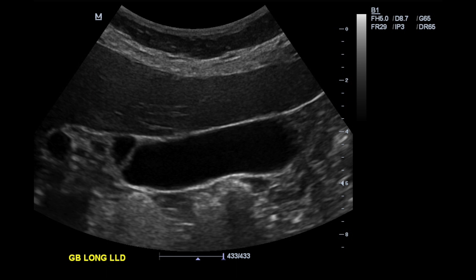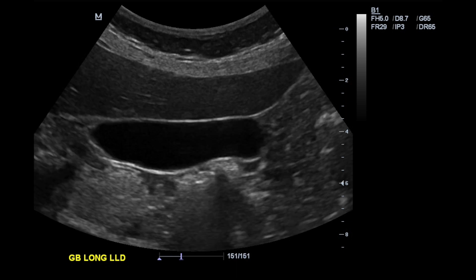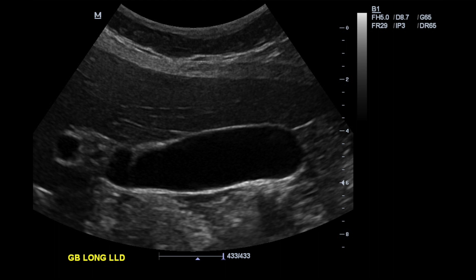Those are all our pictures with the patient supine. Next, we have the patient roll into LLD — left lateral decubitus — so the patient turns onto their side. We then repeat the same protocol. The reason we do this is because the gallbladder isn't in a completely fixed position. When you roll onto your side, the gallbladder flops over as well, and any debris or stones that settled in a position you couldn't see in supine may now become visible. You can watch sludge move or watch stones roll.